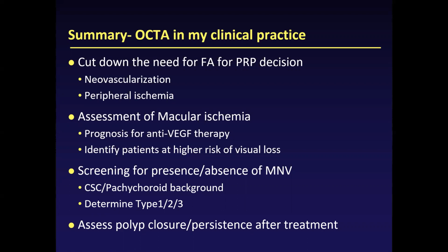OCTA shows me the structural nature of the neovascularization as well. So with that, I will end my talk, and once again, thank you very much for the opportunity to share.